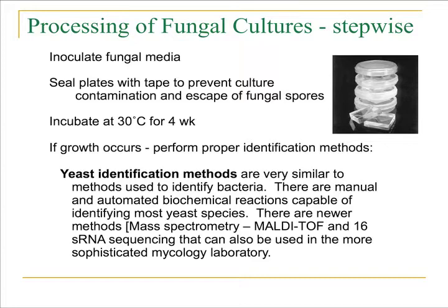There are newer methods, however, that have also been applied to yeast identification, and these include mass spectrometry, such as MALDI-TOF, and also 16S RNA sequencing that can be used in more sophisticated mycology laboratories, particularly to identify some of the more difficult to identify yeast.